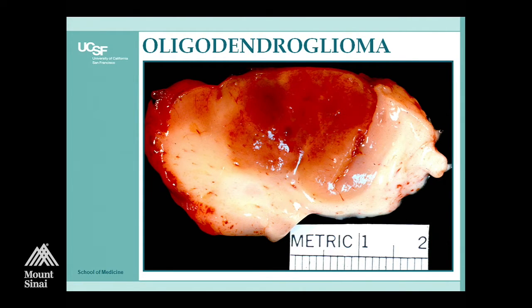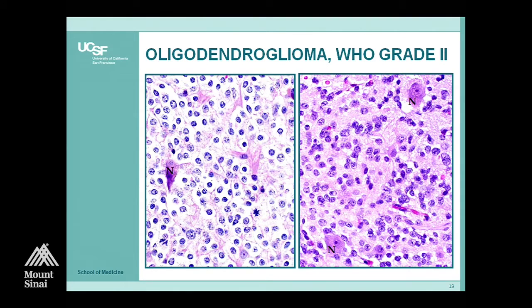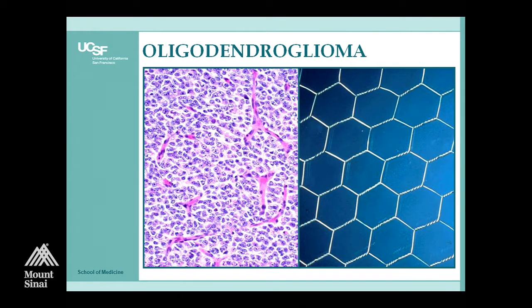Oligodendroglioma, this is all review, of course. They tend to be more cortically based, as you see here. And in the really nice classic example, they have the fried egg appearance, which is a formalin fixation artifact, so if you're still in the last lecture and doing frozen sections, you're not going to see that on your frozen sections. More importantly, perhaps, for morphologic criteria is the monomorphism of these round regular nuclei, and this is how we've been practicing for many, many years, and this is basically the definitions that we've had. The vasculature is often a little different in the oligodendrogliomas.